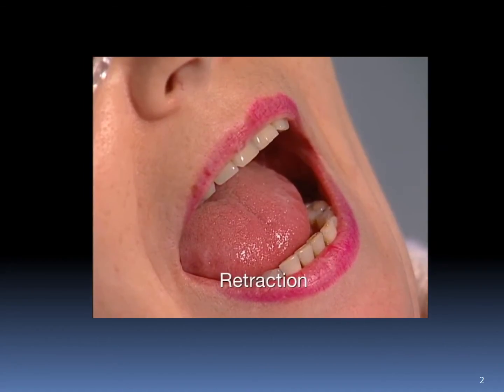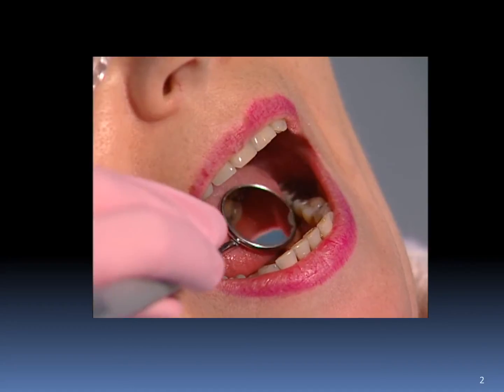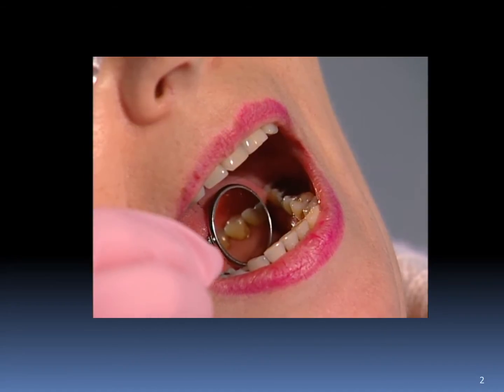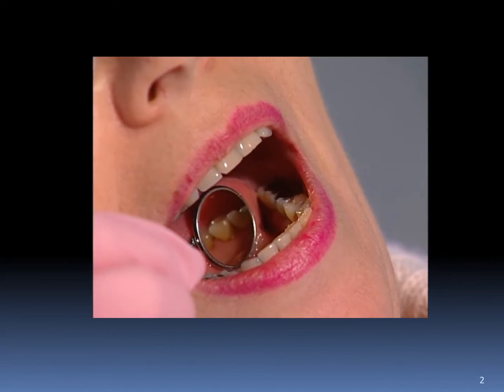Retraction is the use of the mirror head to hold the patient's cheek, lip, or tongue in order to view tooth surfaces that are otherwise hidden from view. Here, a dental mirror is used to retract the tongue away from the lingual surfaces of the mandibular teeth.